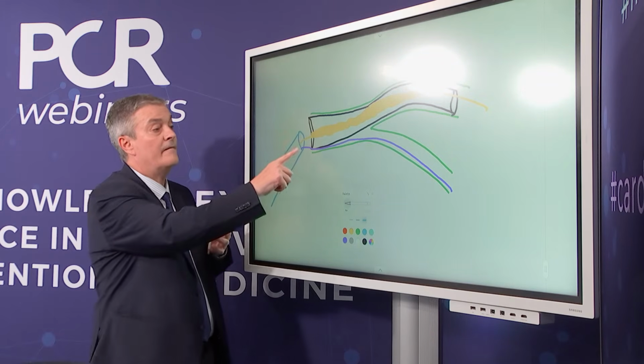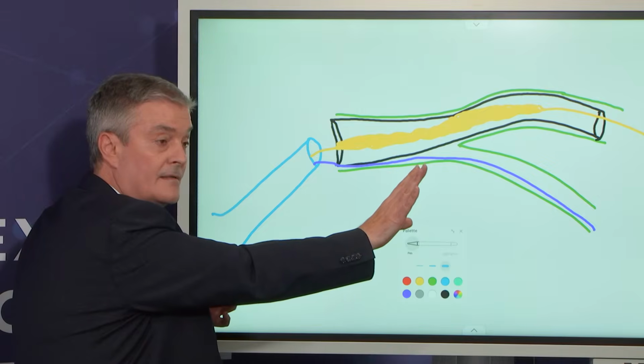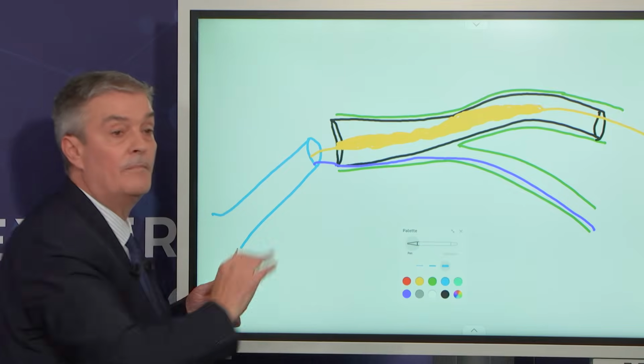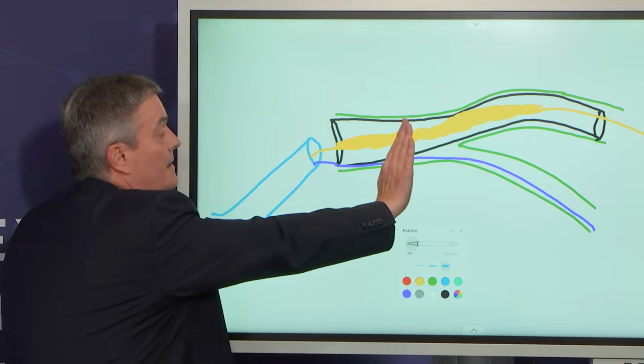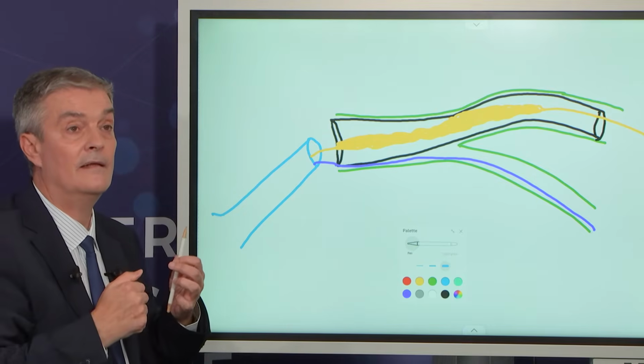And having a wire which is jailed without a fully deflated stent, when you pull back your device outside, your catheter gets sucked inside. And you actually damage the proximal edge by the guiding catheter that unintentionally enters inside the left main.